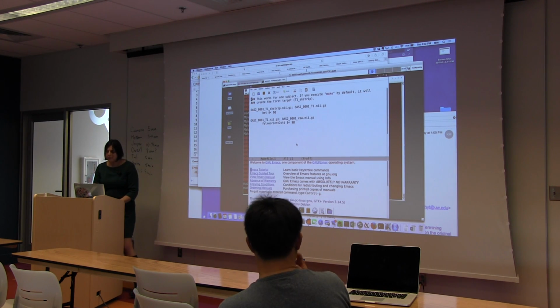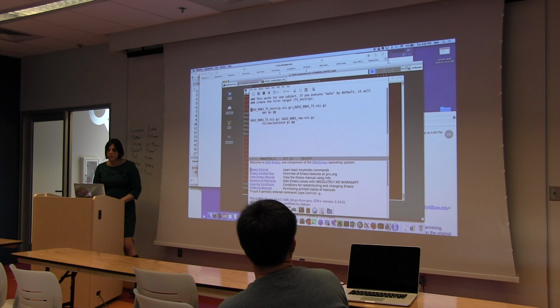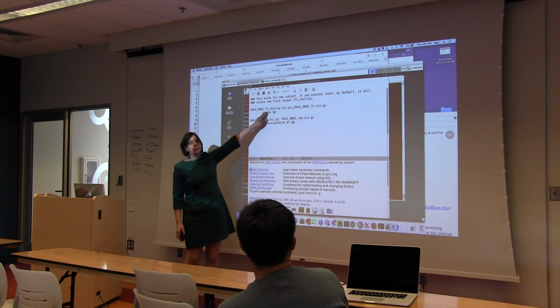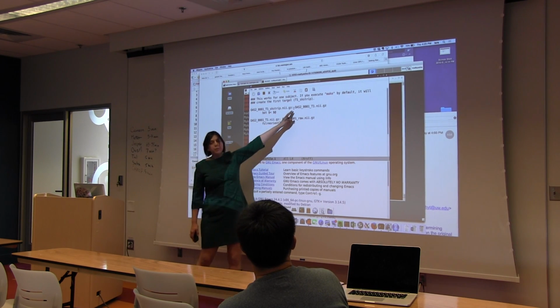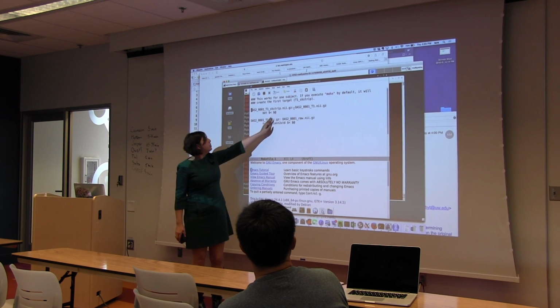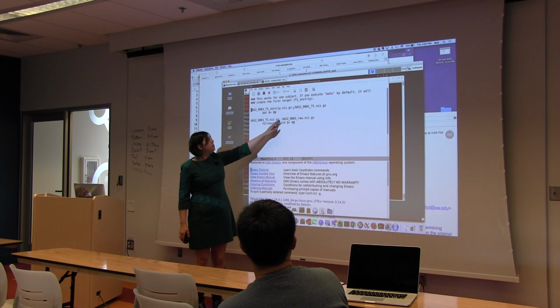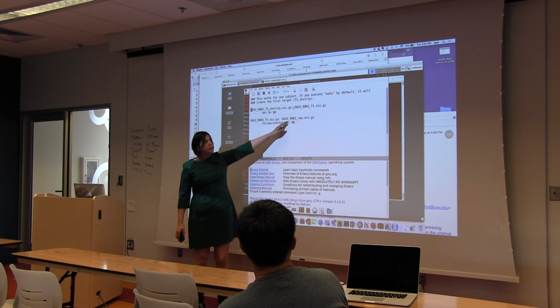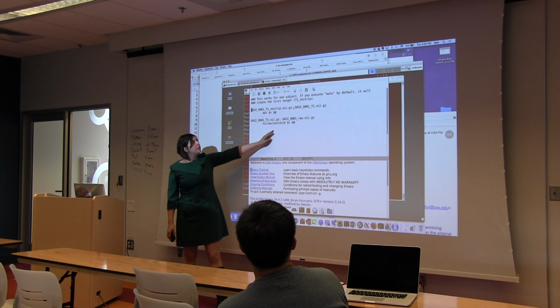So what we have here is the format where we're skull stripping one person. We list the target here, and what we want is the skull stripped T1 image. We give it a nice name, and then we say that it depends upon the T1 image, and we run bet on it. To get the T1 image from the raw image, we put that file list there, and then we say it depends upon the raw image, and then we do reorientation of it, right?